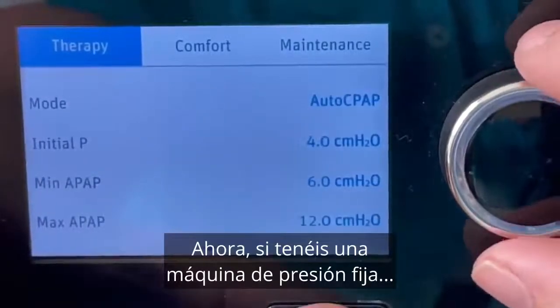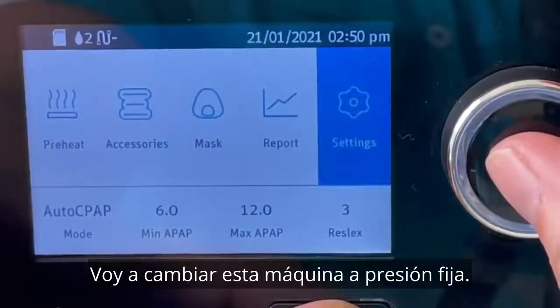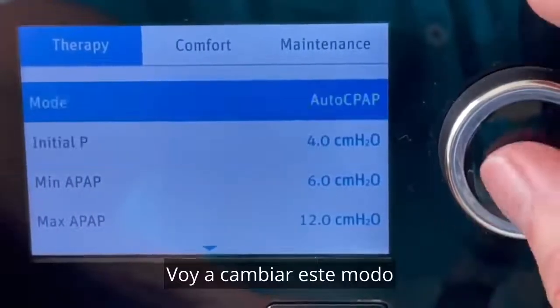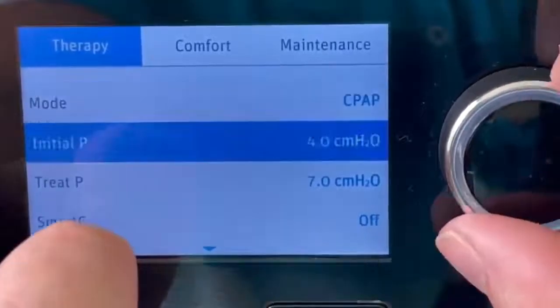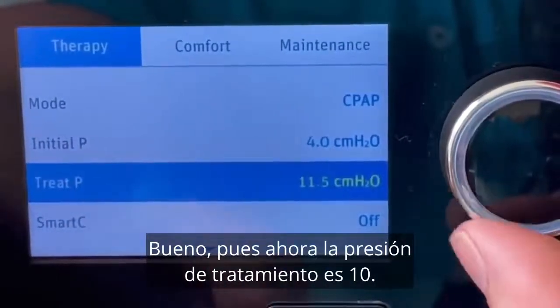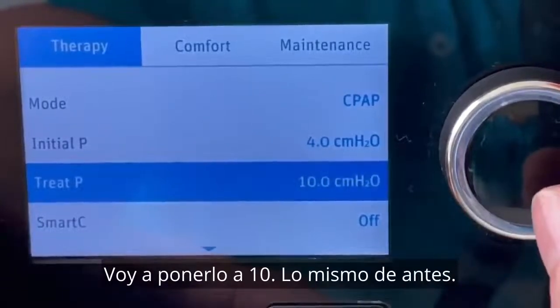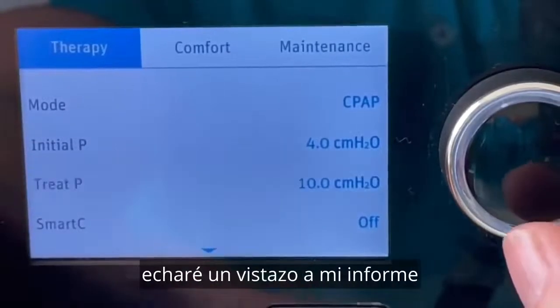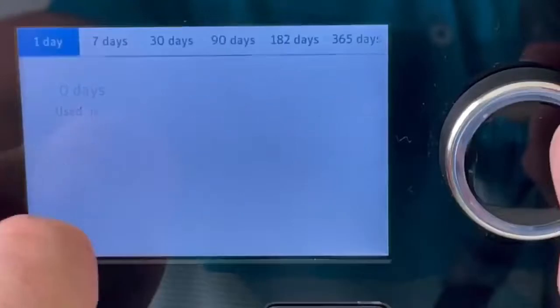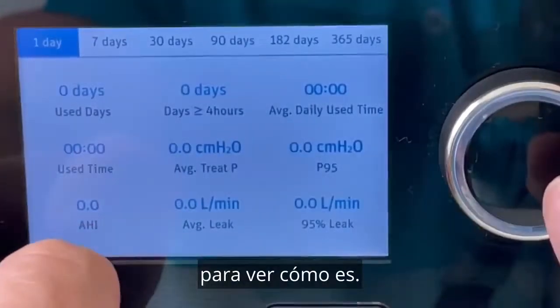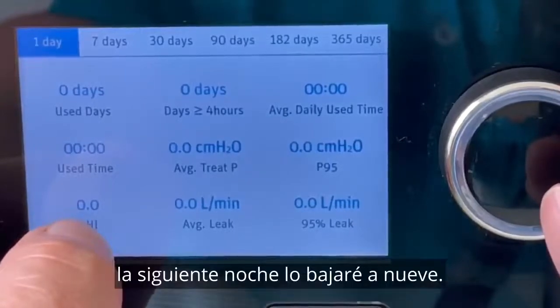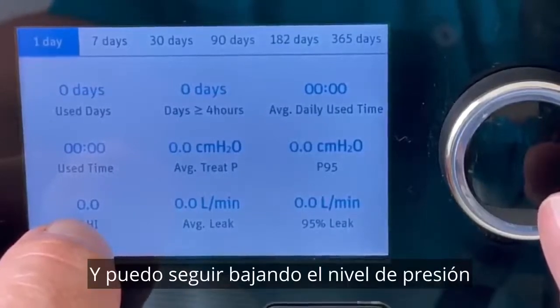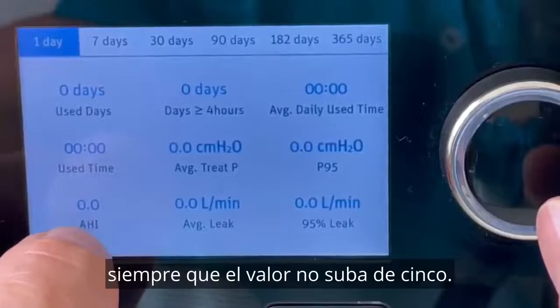If you're on a fixed pressure CPAP machine — where the pressure stays at one level — you do the same thing. I'll change the mode from auto CPAP to CPAP, and now my treatment pressure is 10. I'll run the machine for a night on 10 centimetres, then in the morning check my report and look at the apnea hypopnea index. If it's below 5, the next night I go down to 9; if it's still below 5, I go to 8 — and I can keep bringing the pressure level down as long as this value doesn't go above 5.